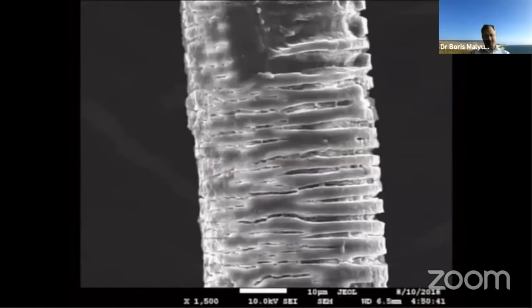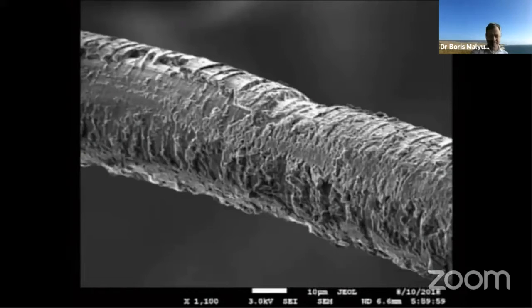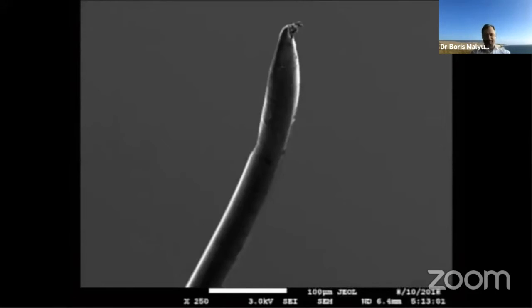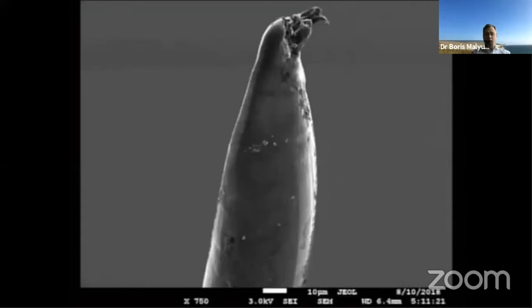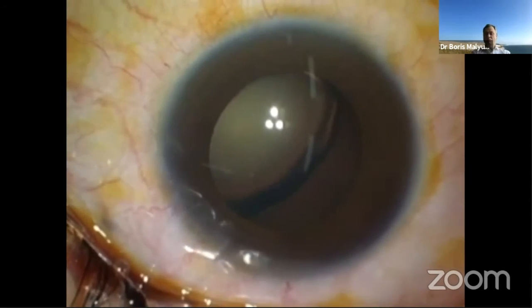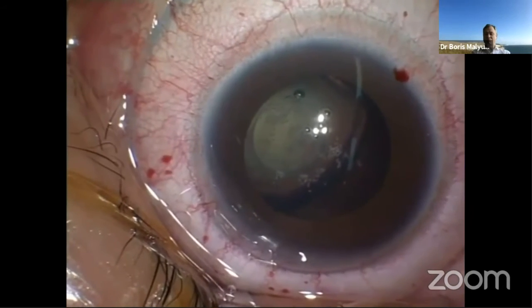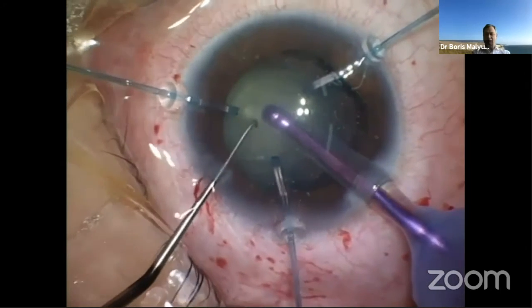We used scanning electron microscopy to examine the suture, and we saw a significant amount of degradation of this 9-0 polypropylene material, as shown here. We also observed thinning of the tips of the suture directly attached to the eyelet of the CTR. Starting from that case, we stopped using 9-0 polypropylene, and this is the current technique, which is illustrated by this video fragment.